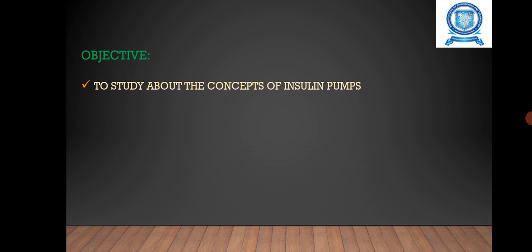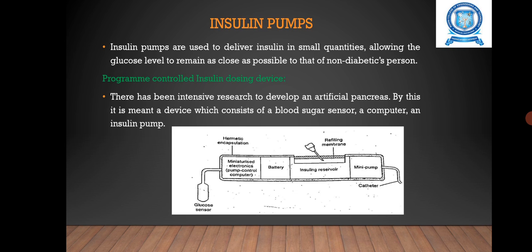Objective: to study the concepts of insulin pumps. Insulin pumps are used to deliver insulin in small quantities, allowing the glucose level to remain as close as possible to that of a non-diabetic person.